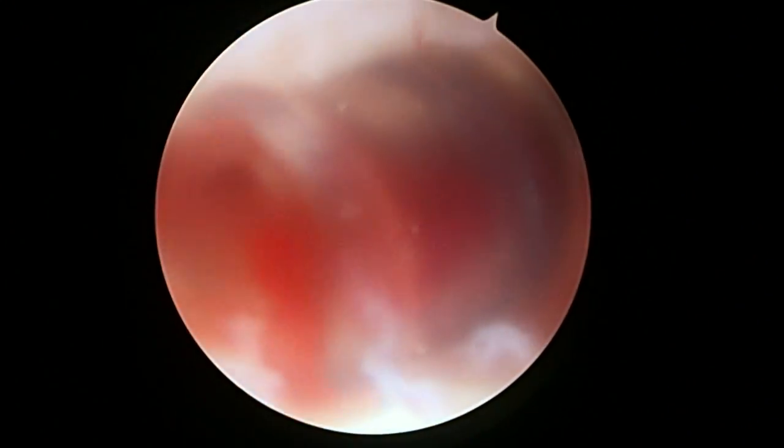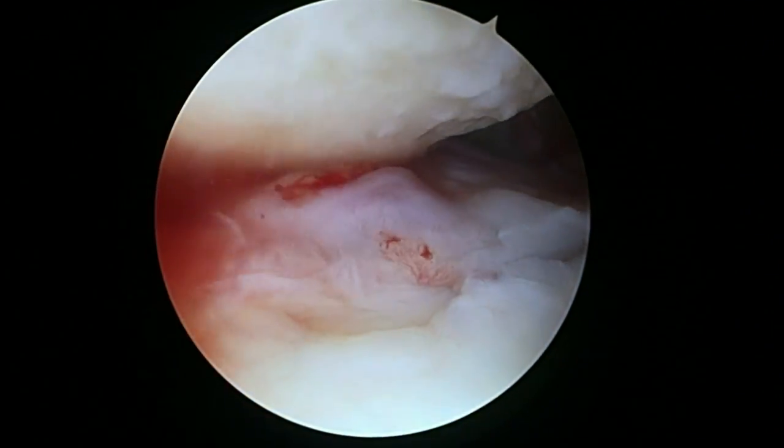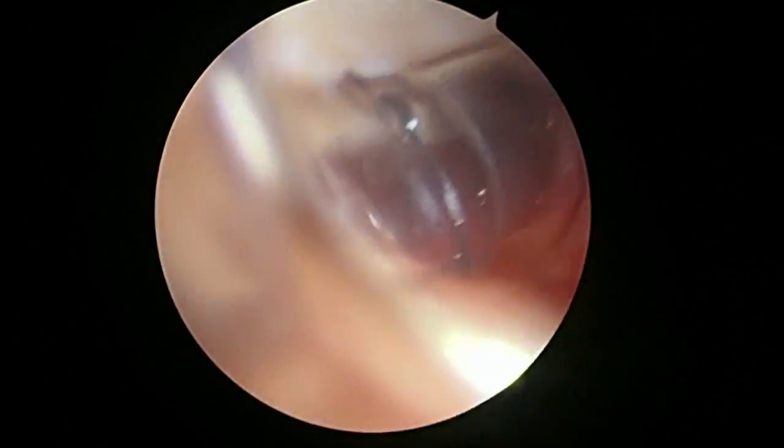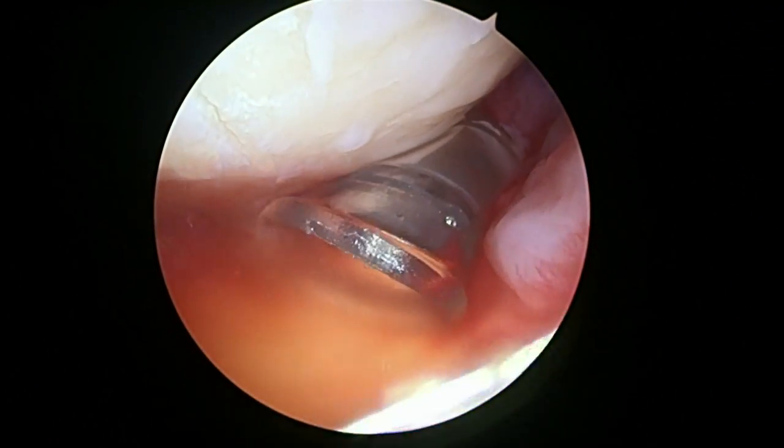Okay, we're just taking all the water out of the joint. We've done the release. Pump is off — that's why it looks this way. We're just going to drain all the water. I just wanted to show you what it looks like when there's no water in. Everything's moving fine; we've released quite a bit. We're going to take out these cannulas and get you back to the recovery room shortly.